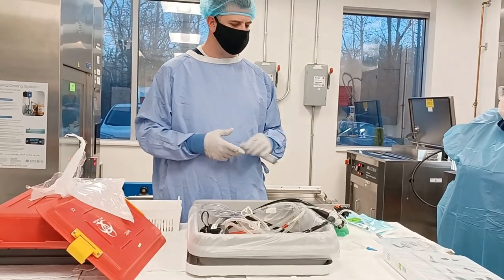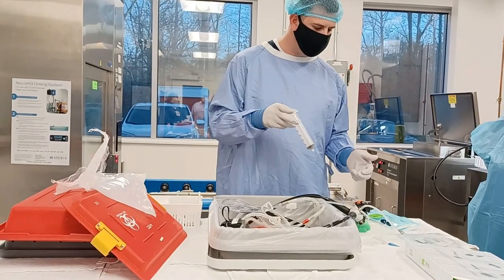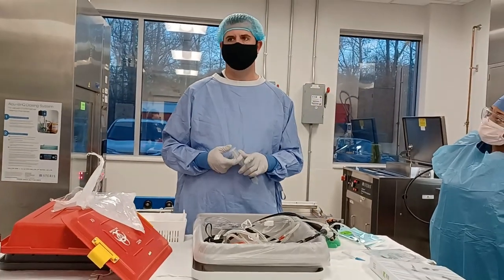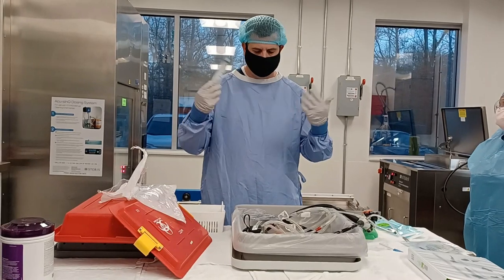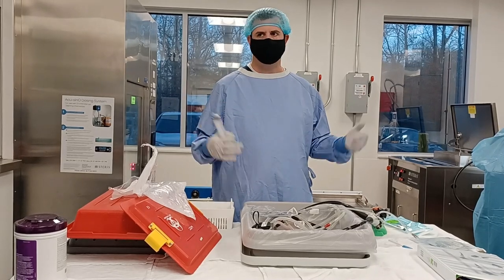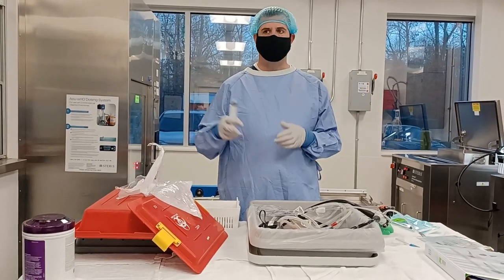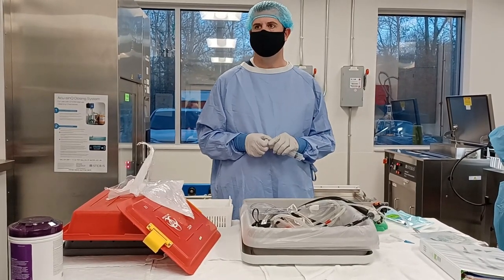If you were to do this without the Scope Buddy, you would always want to flush 100 milliliters of enzymatic water through every port. The more fluid that goes down the scope with enzymatic, the better — more likely to get everything off. The minimum is 100 milliliters, but the more the better to make sure all debris is cleared. Hopefully they're doing their pre-cleaning upstairs in the OR before they bring it down, so it's a lot easier for you all to clean when it gets here, especially if you can't get to it right away.